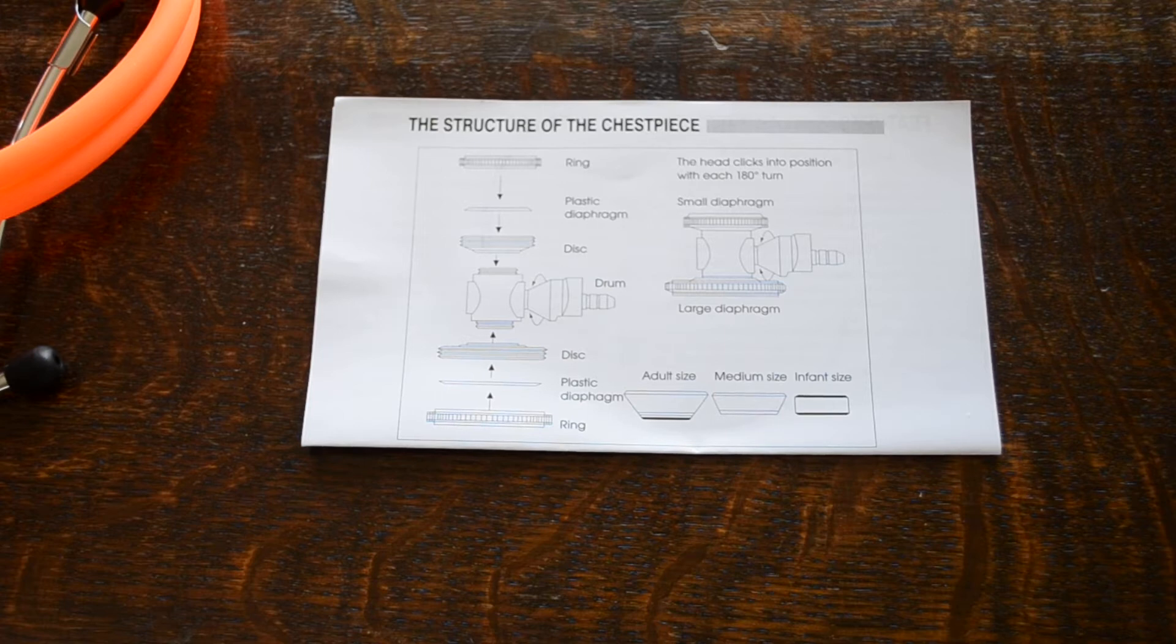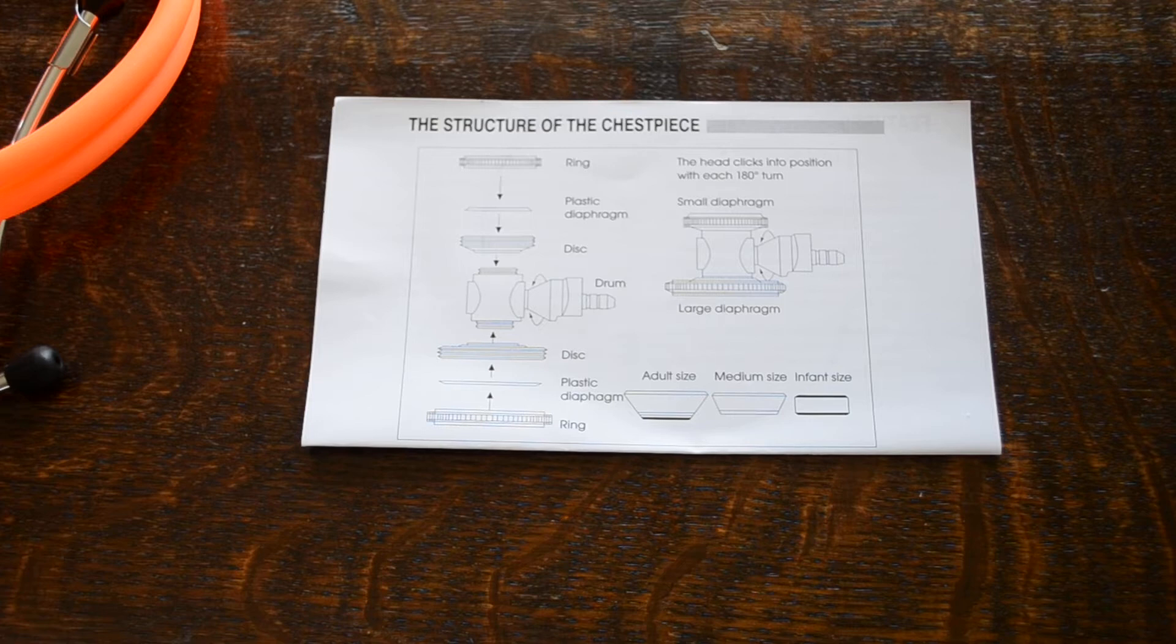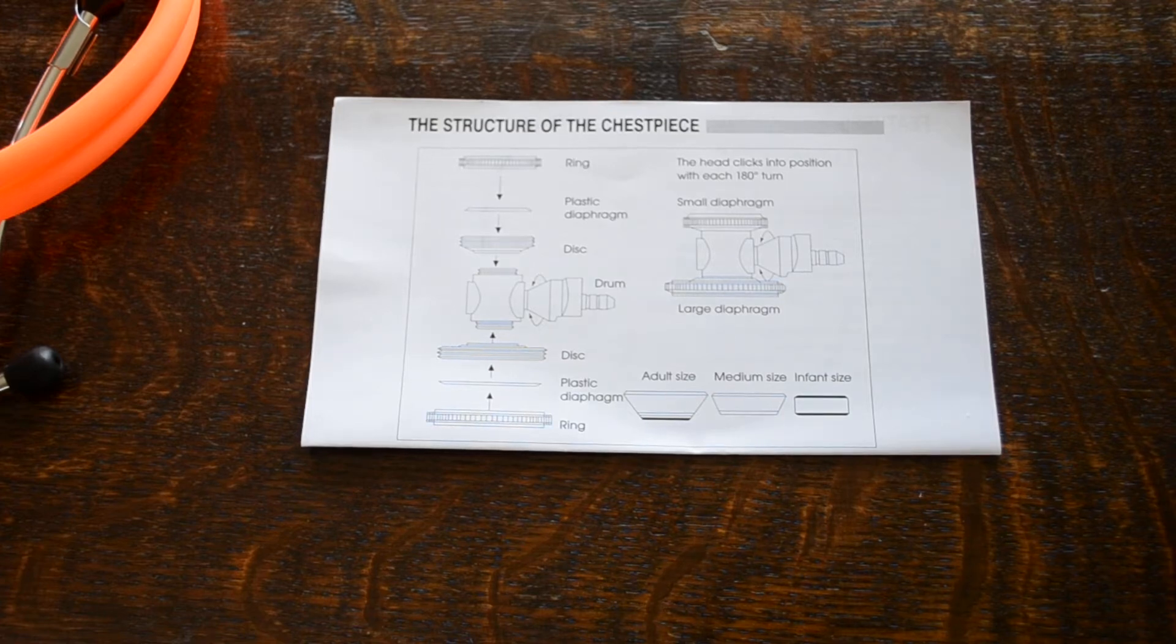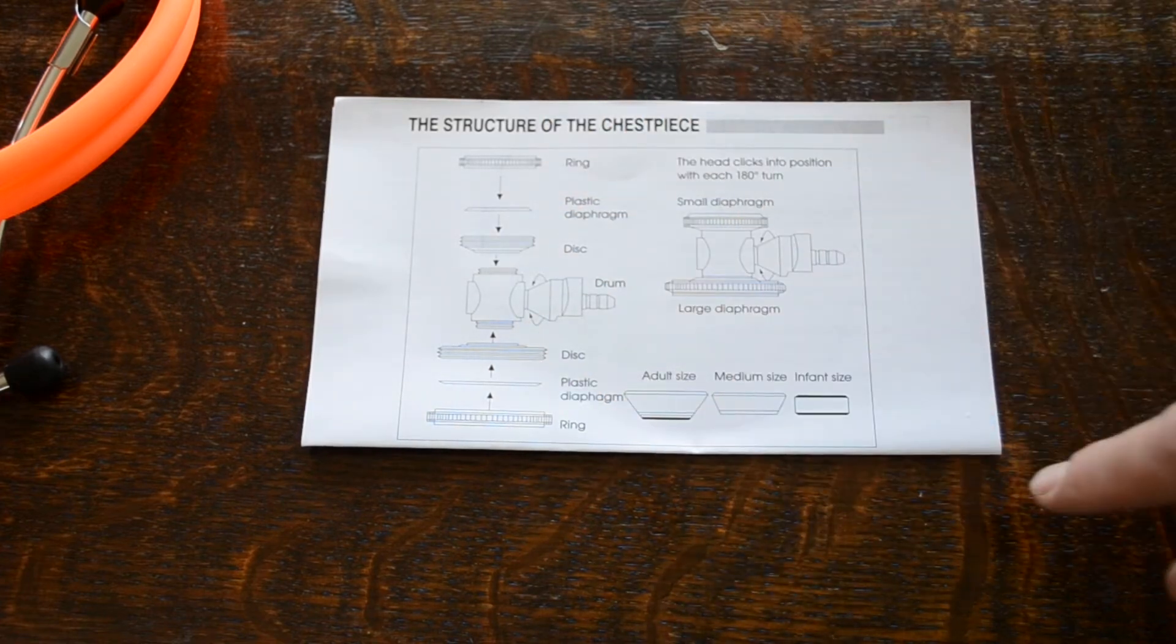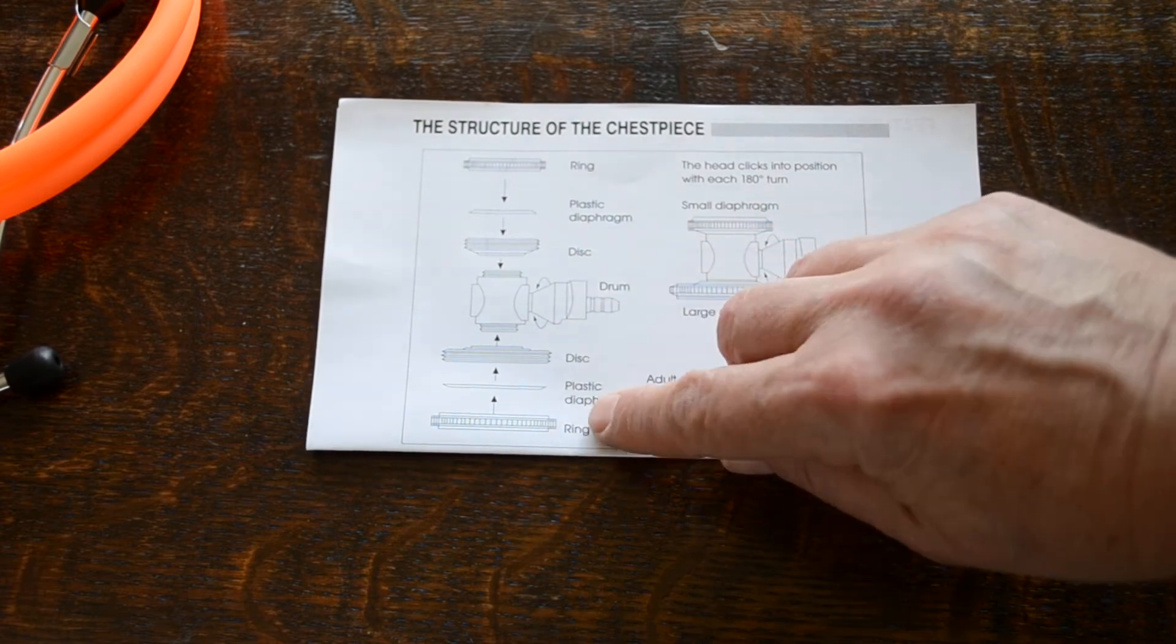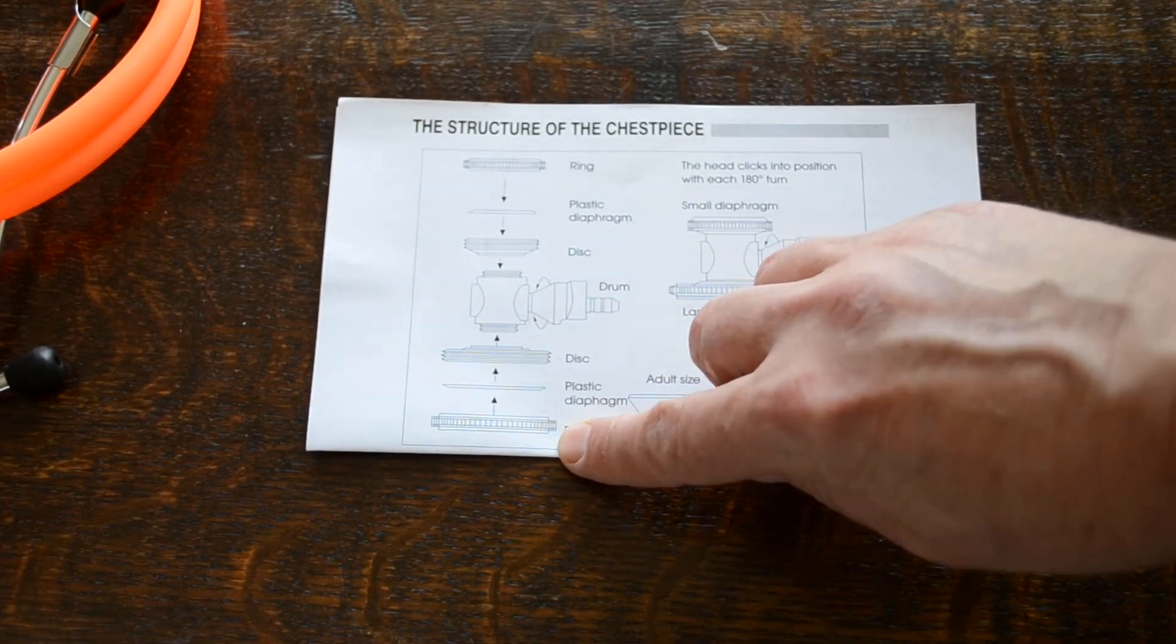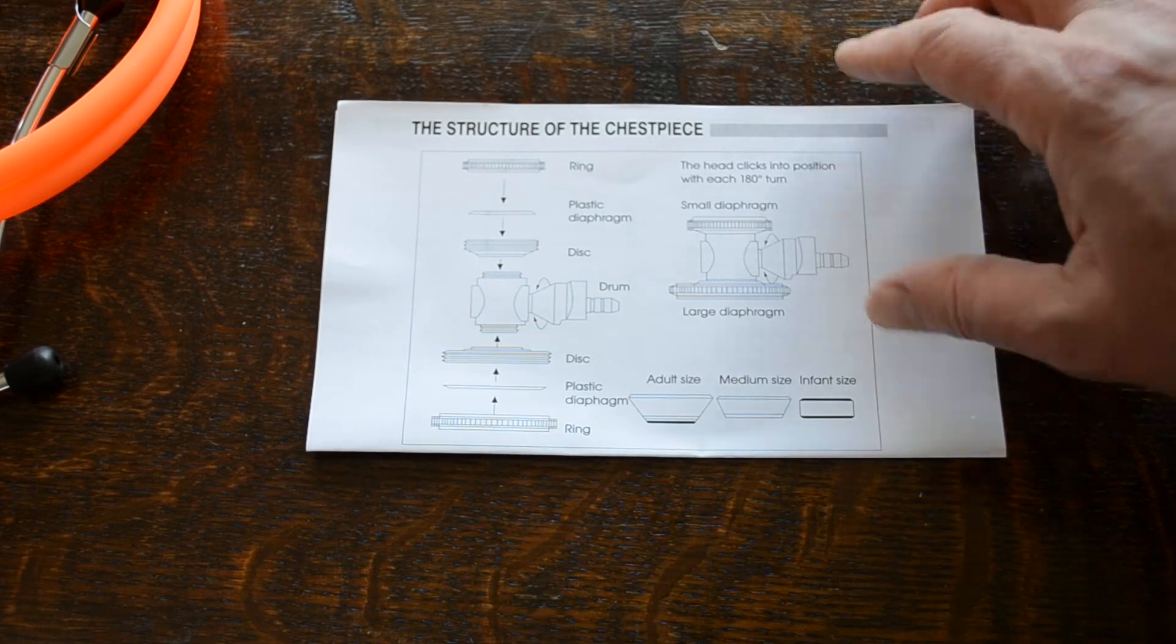As I said, you can have it with diaphragm in the pediatric and diaphragm in the neonate setting. You can have a bell neonate. You can have a bell adult and a bell pediatric setting. And this basically just shows you how to align all the discs and the diaphragms and the diaphragm retention rings on the various settings.